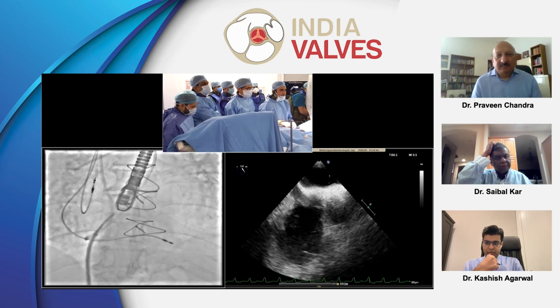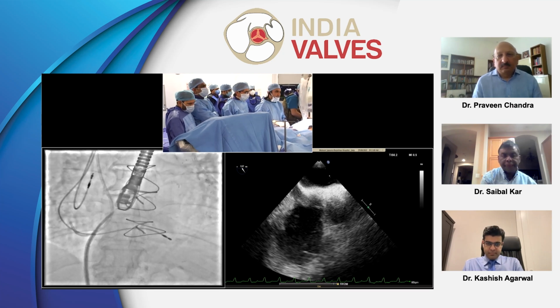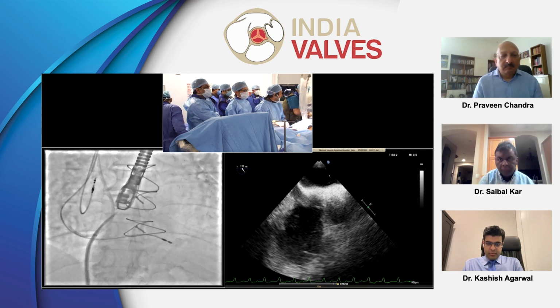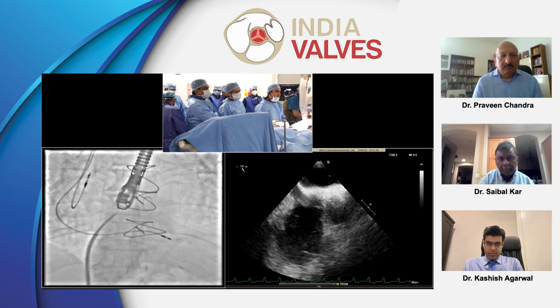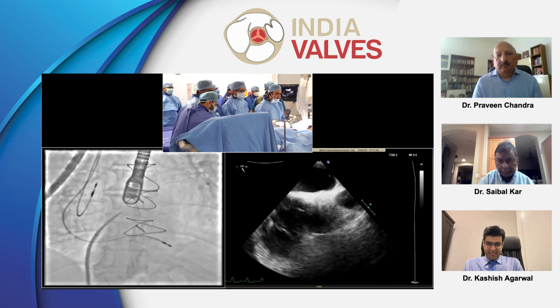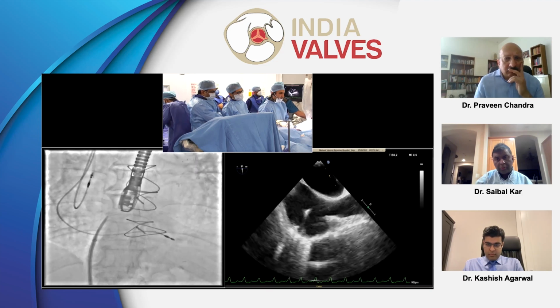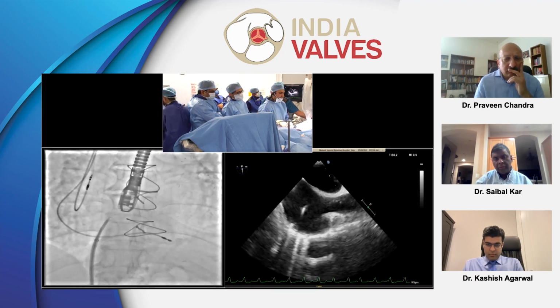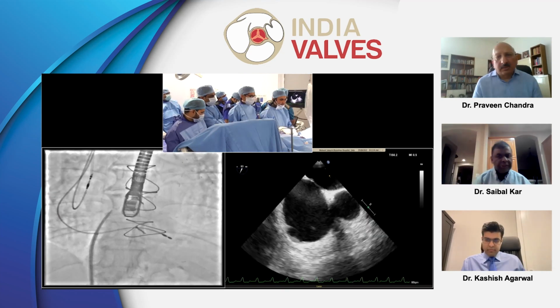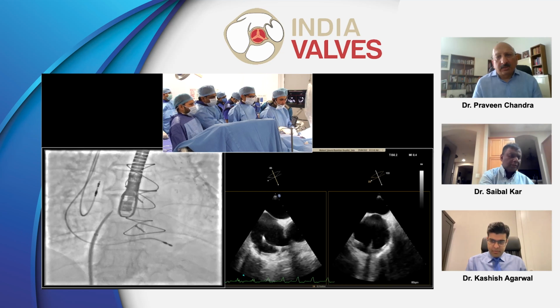Take the posterior leaflet and measure it in a different view. Show your short axis, the posterior. Okay, good. We removed the Swan for the time being because it was coming in the way. Okay, let's look at the septum again, please. Counterclockwise is a problem. I just can't see the tenting. Maybe it jumped out. Even I can't see the tenting. Maybe it's too posterior. Very good. It's a great position. It's mid. That's great.